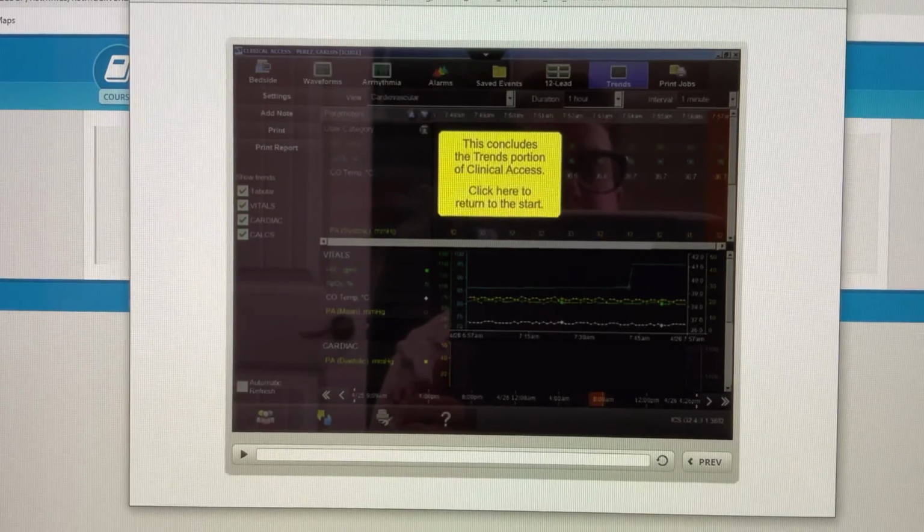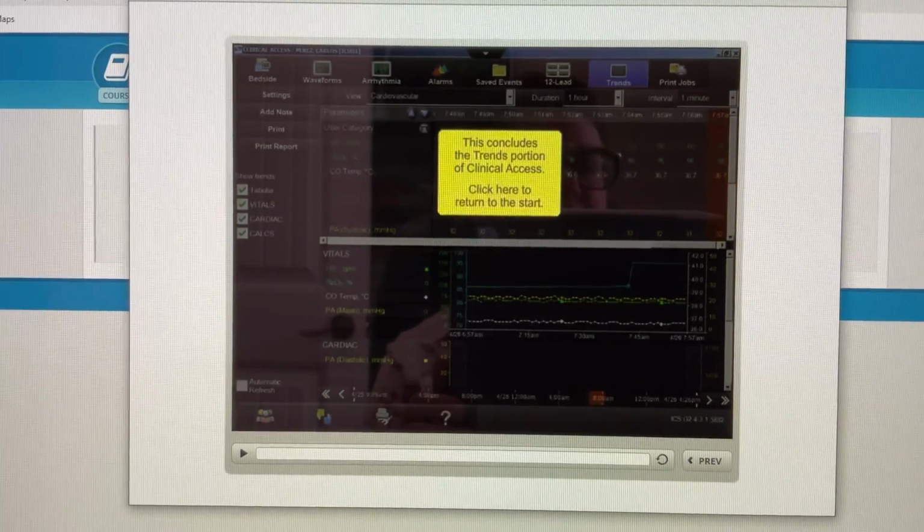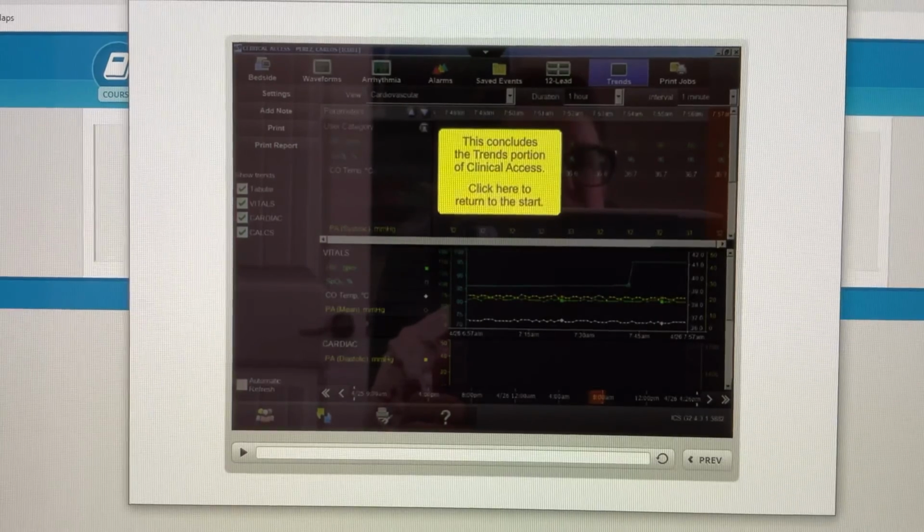And when you analyze the rhythm, you will be able to see at the time that it started and assess the duration. So I think this will make your life a little bit easier once you become confident in your ability to use the components.